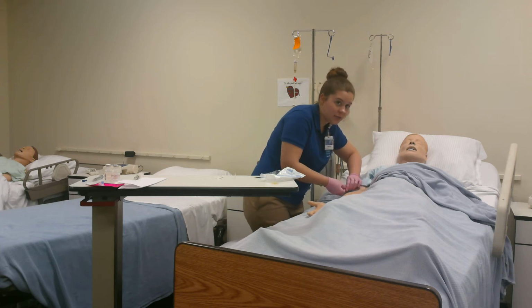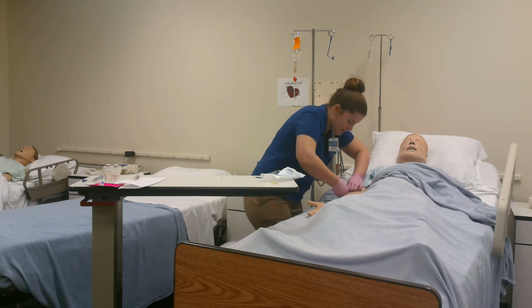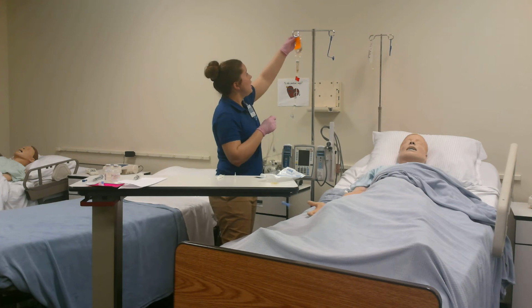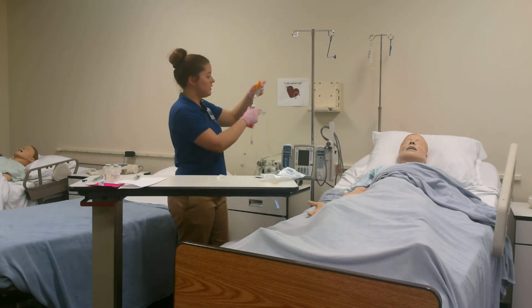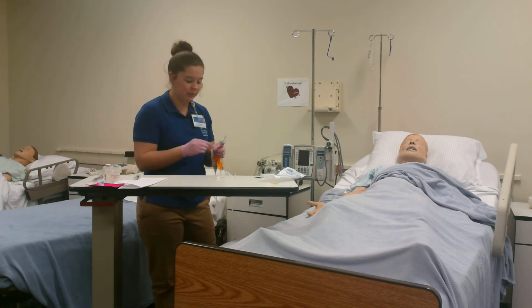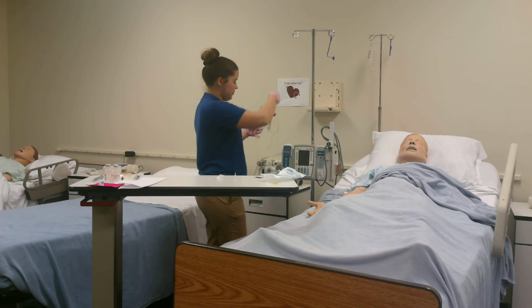Normally it wouldn't be this hard to take off, but there we go. Okay, clamp down. And we're going to leave this medication tubing for the next administration in 6 hours. I would properly dispose of my medication bag. Hang this back up.